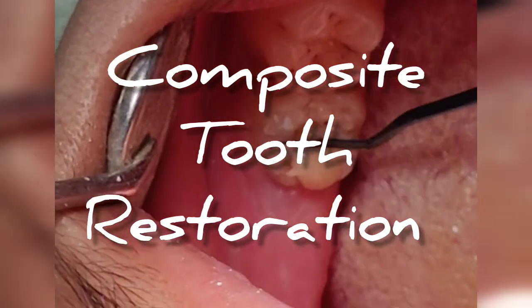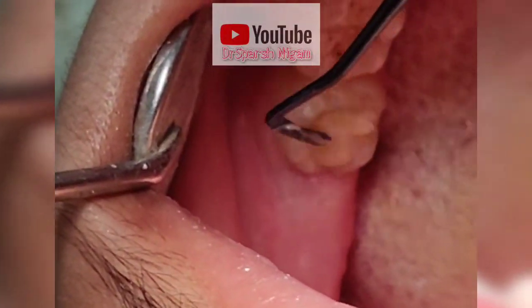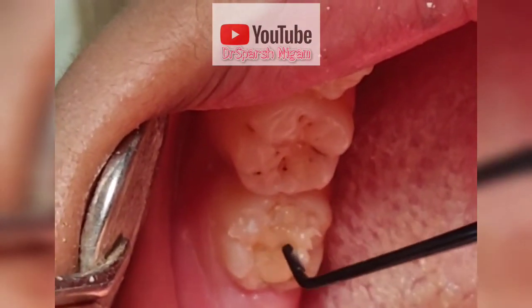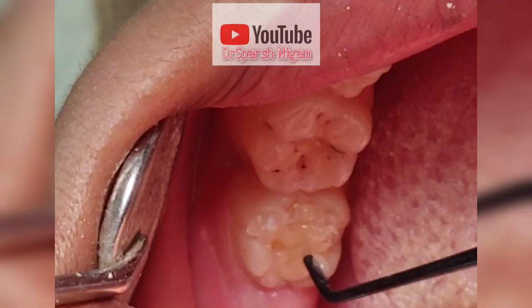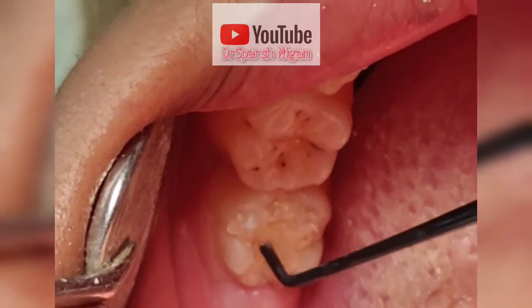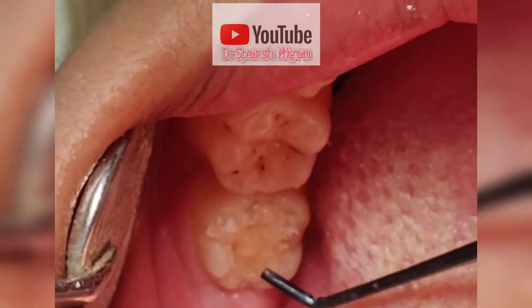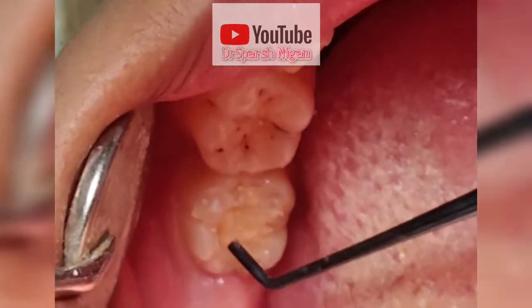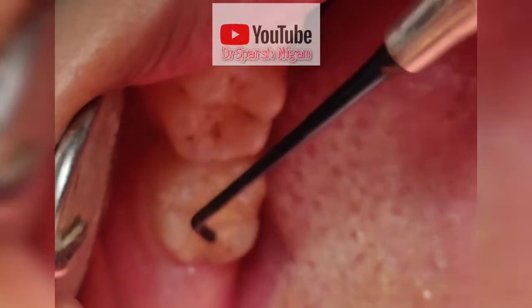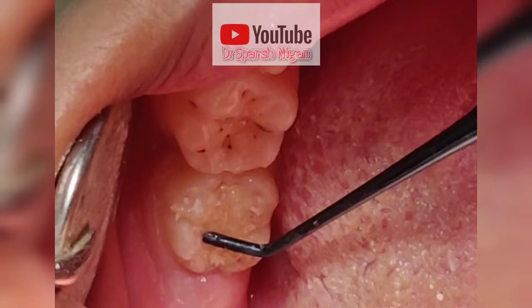Hello friends. Now you can see I am going to fill this tooth. This tooth is already root canal treated and now I am going to start filling it. This is a composite filling. Now you can see I am starting to fill it — slowly packing the composite filling inside the tooth and slowly contouring all the filling around the tooth margins.